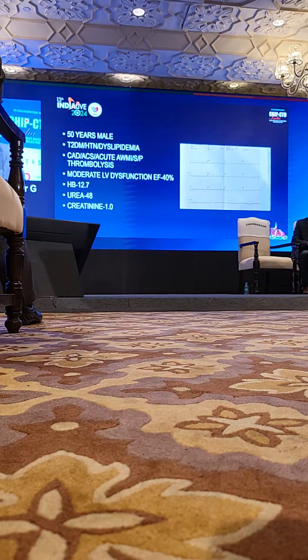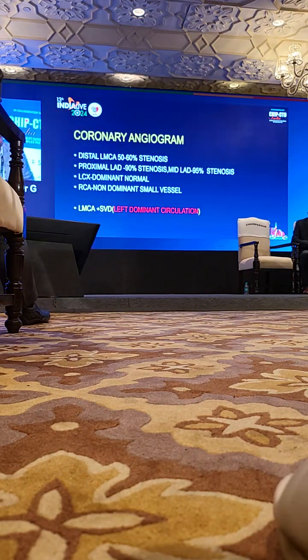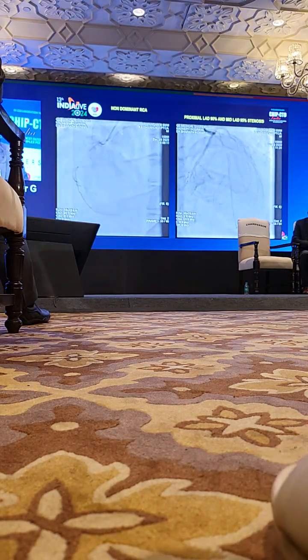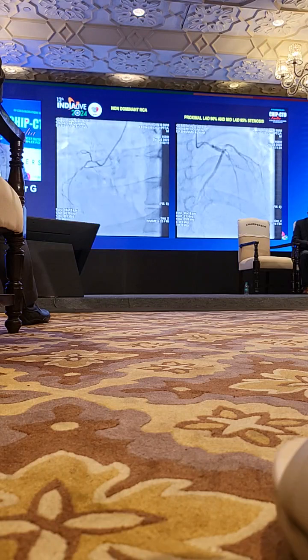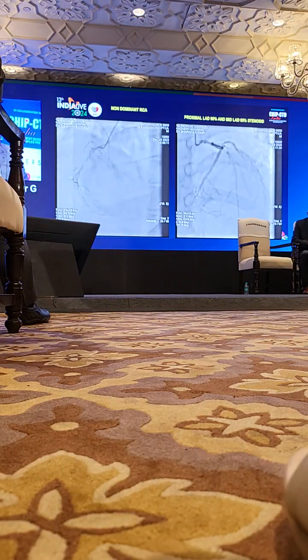Good evening, friends. Thanks India Live for this opportunity. Our patient is a 50-year-old male who is diabetic, hypertensive and dyslipidemic, who had a recent anterior MI and was thrombolysed. He had LV dysfunction with an EF of 40%. Hemoglobin and renal parameters were normal, and this is the ECG. Then I took him for a coronary angiogram. It showed left dominant circulation and the LCX is normal. This is a non-dominant RCA.